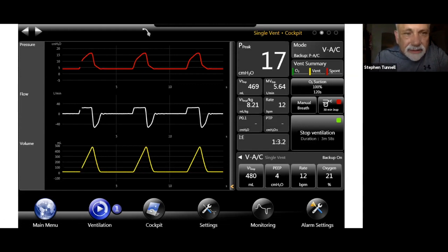Steve? Yeah, I was going to say, Graeme, I think in general, when I have configurability and I'm ventilating a patient, the decision of how to set up my user interface is usually: I would look at what mode I'm in, and then what are going to be the dependent variables of importance, and I would want to see those. Then I would look at what the patient type is and also where the patient is in the stage of their disease. Obviously, I could care less about P0.1 if they're sedated, or I wouldn't be worried about PTP if they're not triggering.